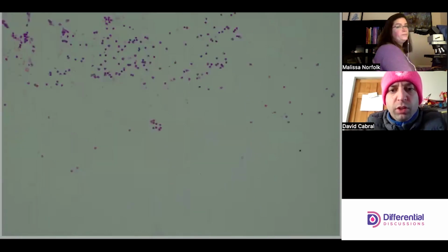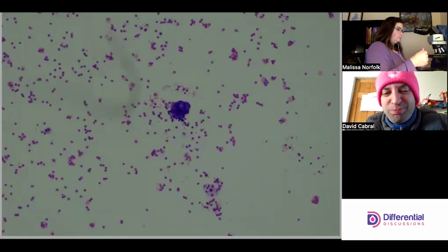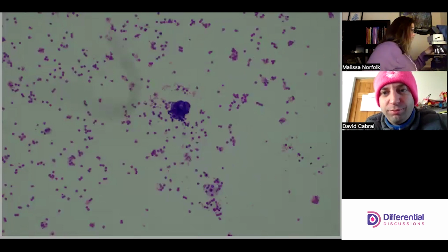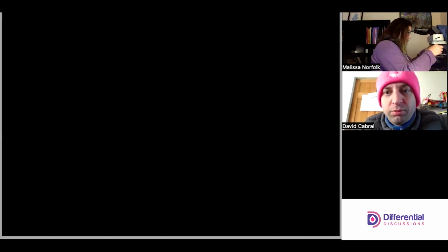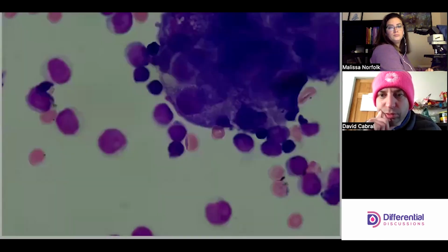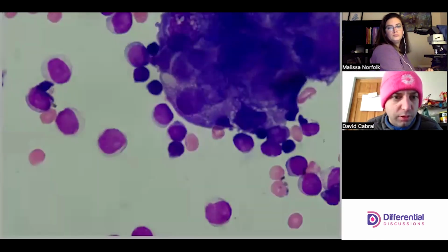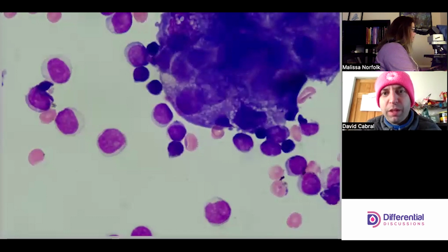When you go back to one of the blobs and drop down, we'll formalize what we think we already know. Is the light good on that, Dave? Looks good. Yeah, I like it.